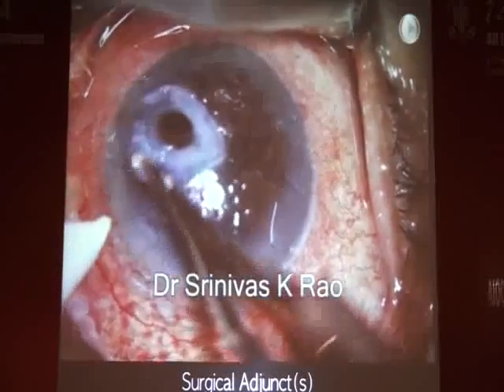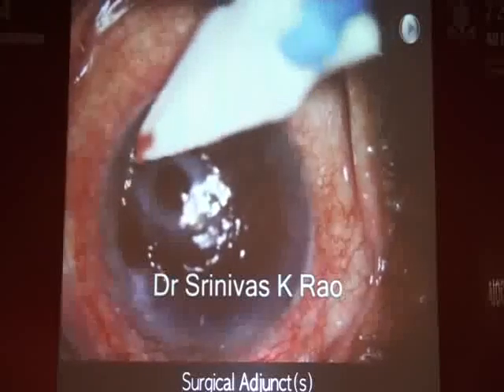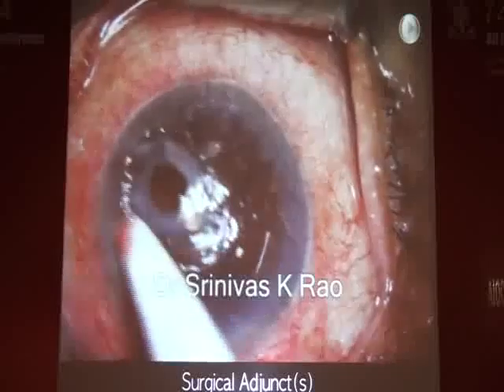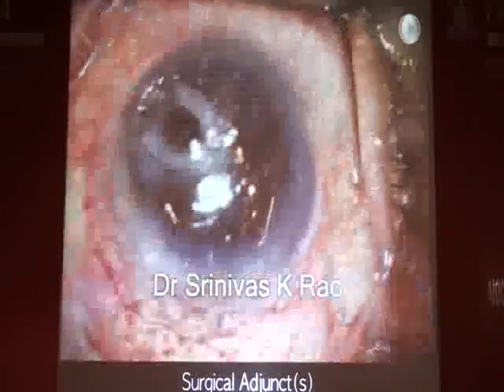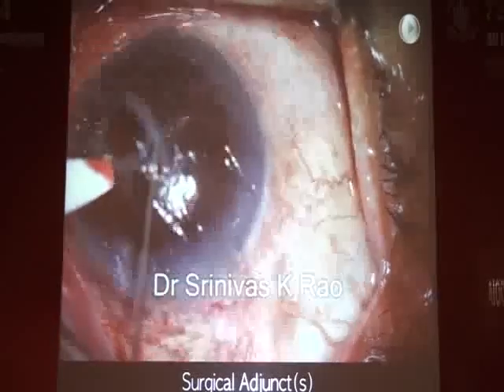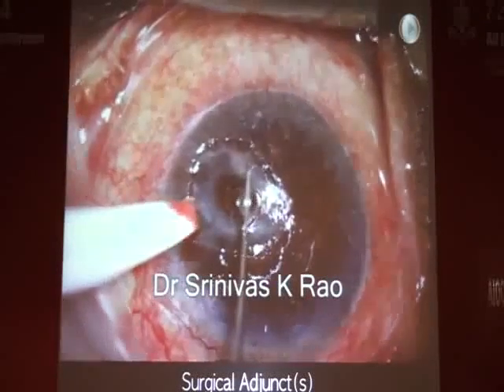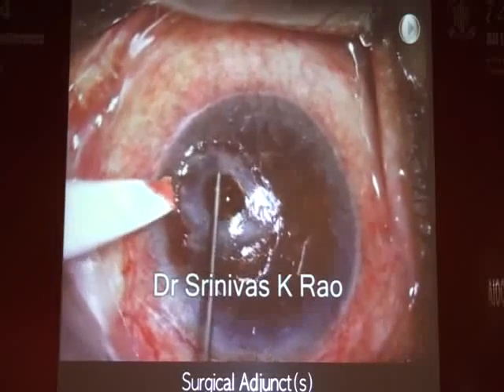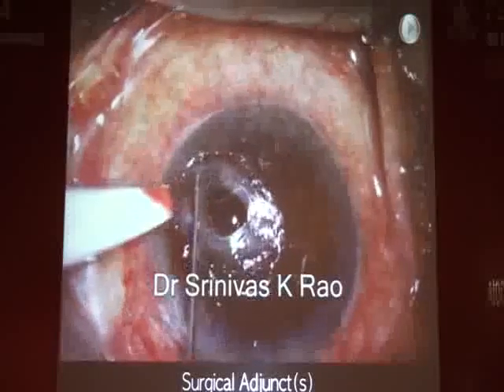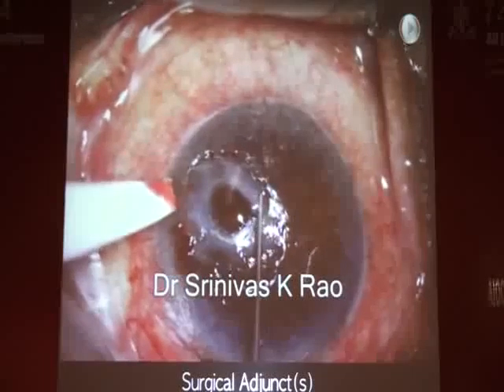and expose that area completely, we then can dry that area thoroughly because the glue tends to polymerize in contact with any liquids, and then you can get the glue in a 1 ml syringe with a 30 gauge needle. And if you can get the patient to stop moving his eye for just a second, you could use that little drop on the tip of your needle to paint it into place over the entire area that's ulcerated. And just take care to have a nice thin film. You don't want to have mountains and valleys because then placing the BCL becomes a little difficult.